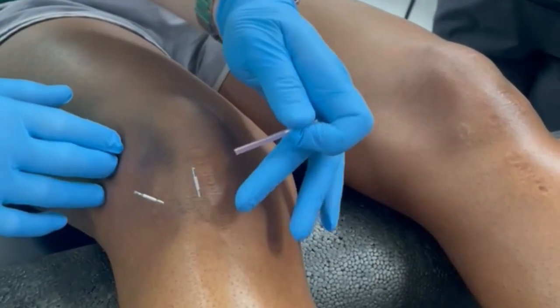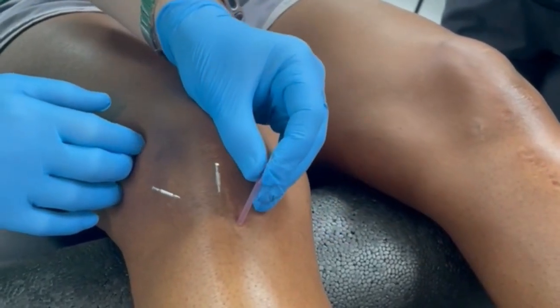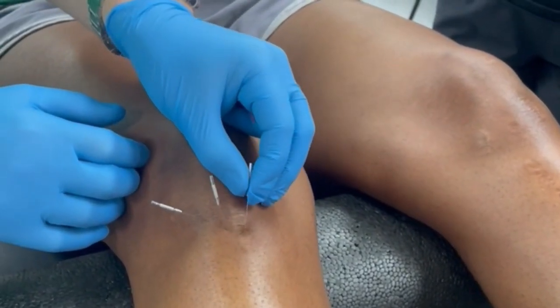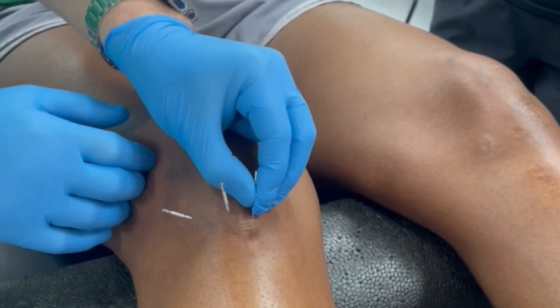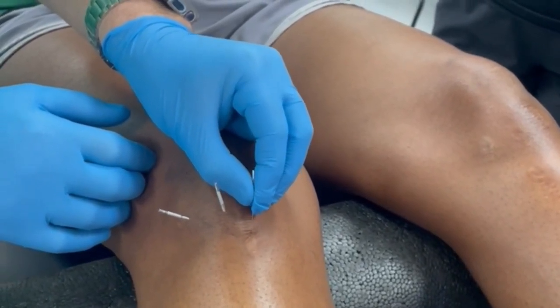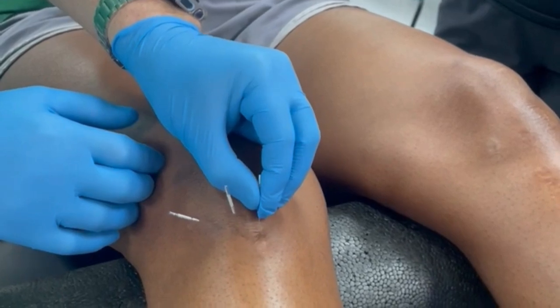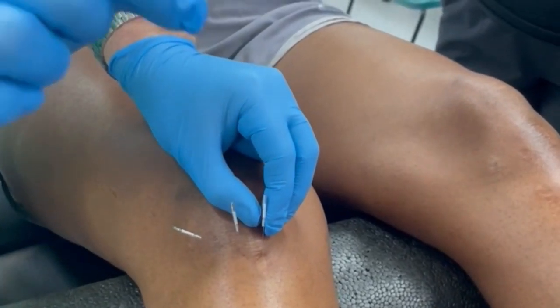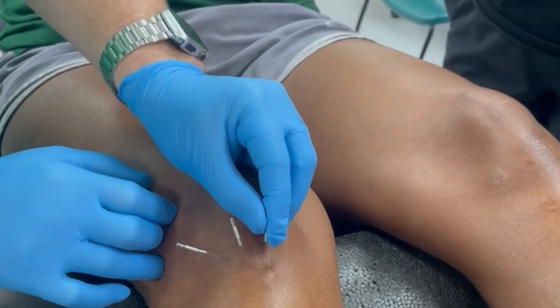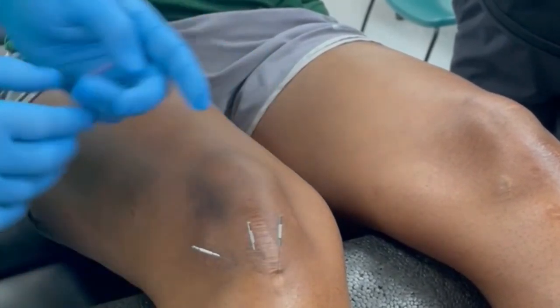It just feels gummy and it hurts. That's the one — right on her tuberosity, tapping that, obviously through her incision too. It's like hit it, gummy, grab it, and then coming back off of it. And then we're just irritating the periosteum. It's irritated.